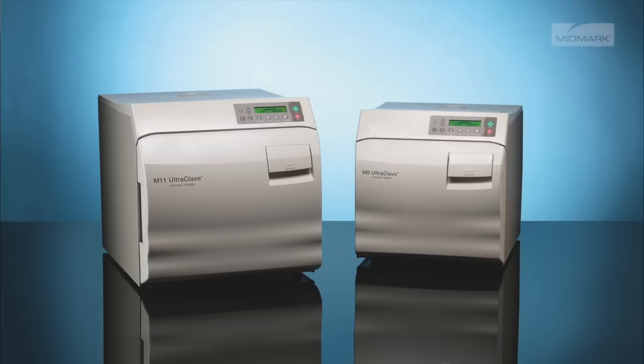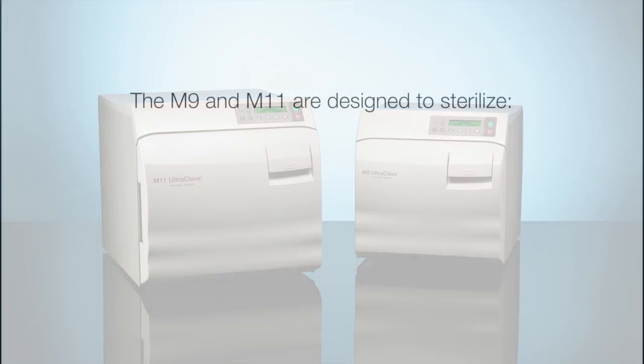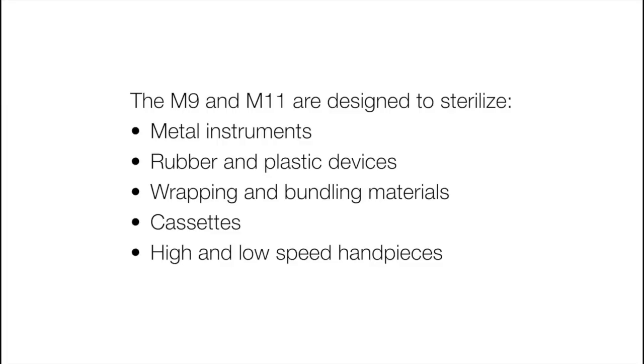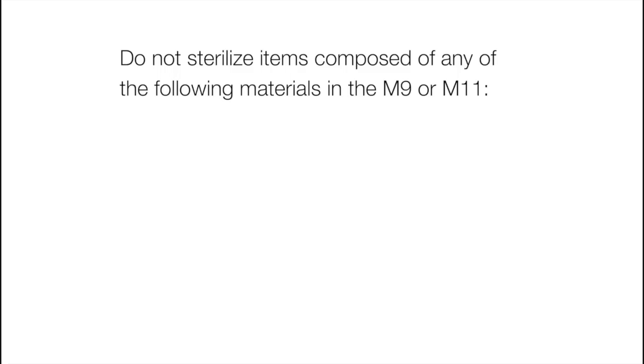Before placing any instruments into the autoclave, check with the manufacturer to be sure the materials are compatible with steam sterilization and verify acceptability of sterilization parameters. The M9 and M11 are designed to sterilize metal instruments, rubber and plastic devices, wrapping and bundling materials, cassettes, high and low speed handpieces, and surgical instruments.